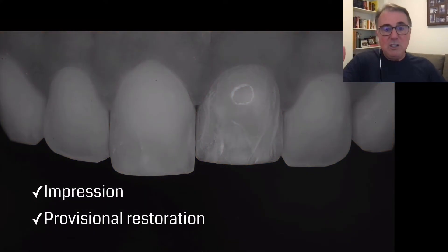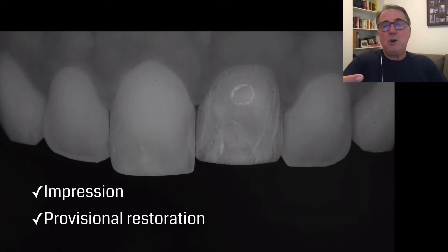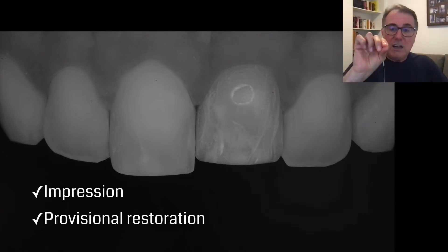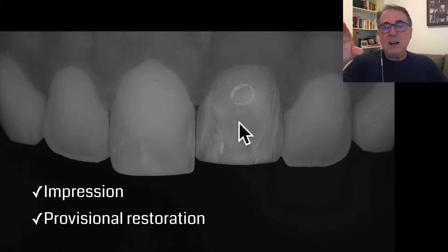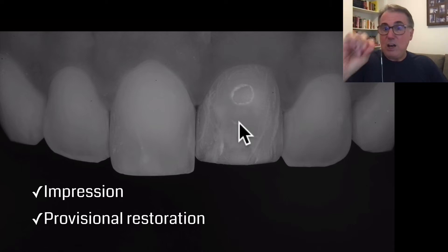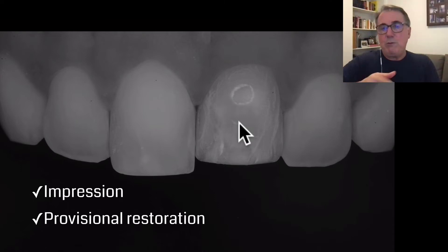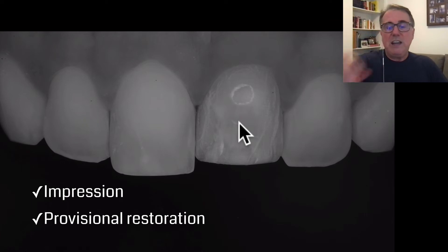Here is the image with the polarizing filter. Now I take the impression and do a provisional restoration. Usually for one tooth I do a direct freehand bonding composite — just a spot conditioning with a small amount of acid etch in the middle of the crown. I wash it, then use a regular bonding agent — not a universal or self-etching bonding agent — and do my restoration. It usually holds well until the next appointment.